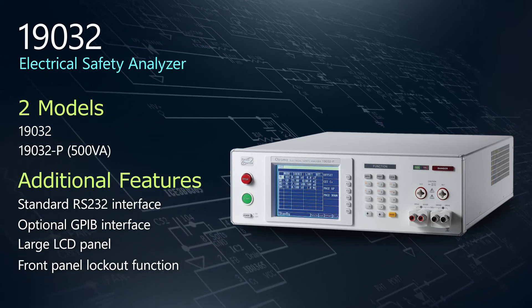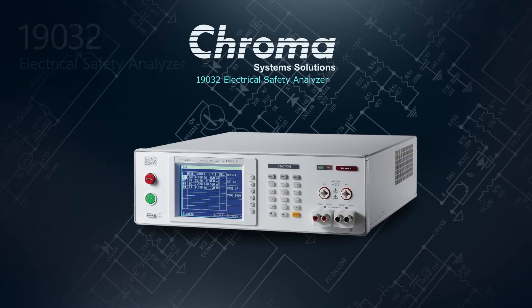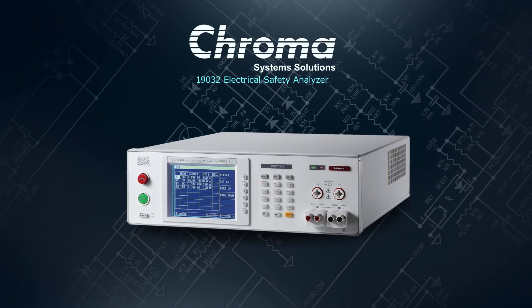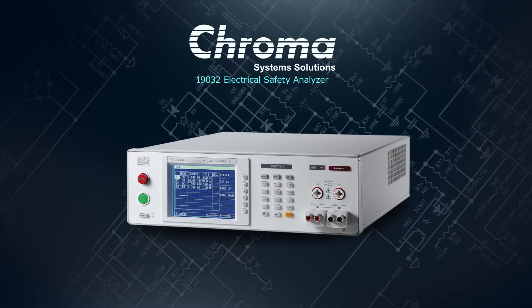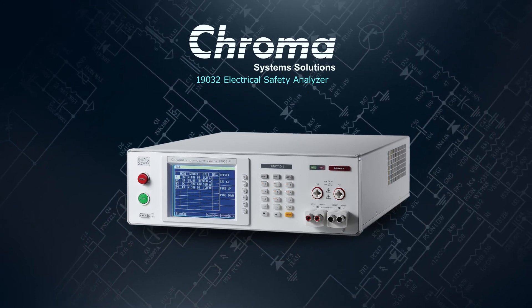And of course, we offer a ton of options to fit your needs. From medical devices to consumer electronics, the multifunction 19032 Electrical Safety Analyzer is the right choice for ensuring your products are compliant with the most demanding safety standards.